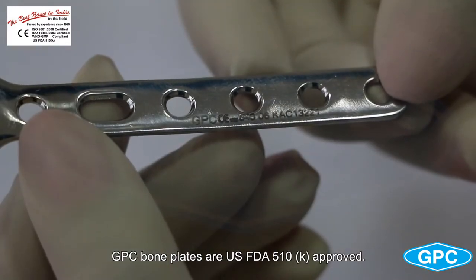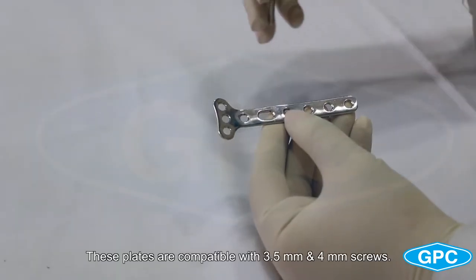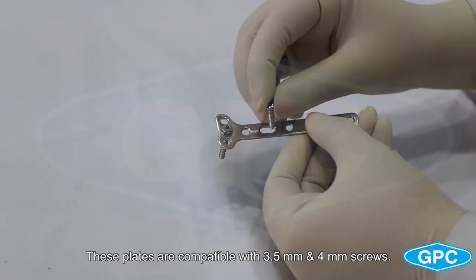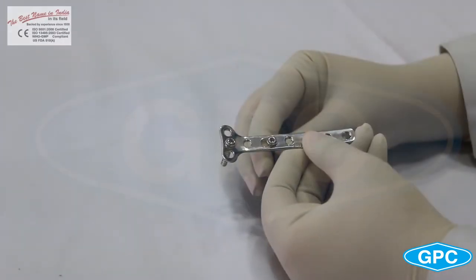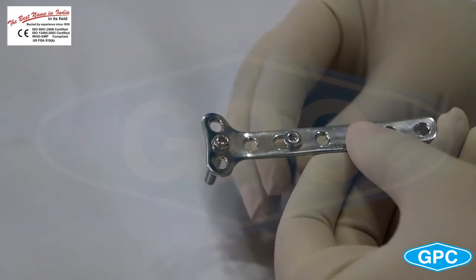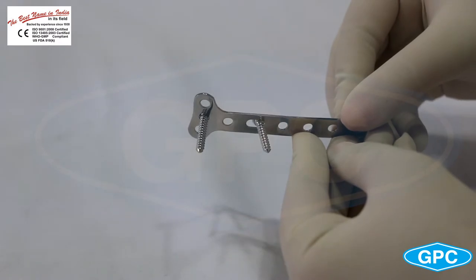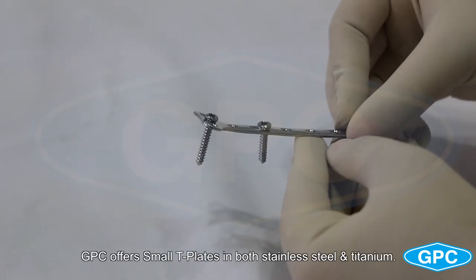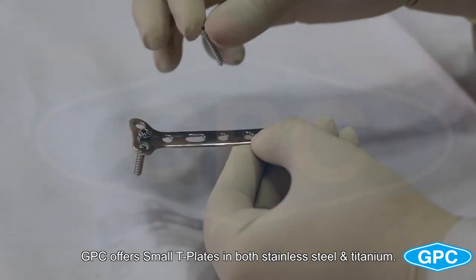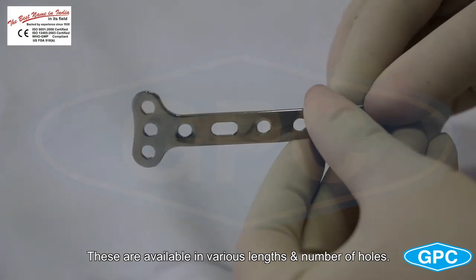GPC bone plates are USFDA 510K approved. These plates are compatible with 3.5mm and 4mm screws. GPC offers small T-plates in both stainless steel and titanium, available in various lengths and number of holes.